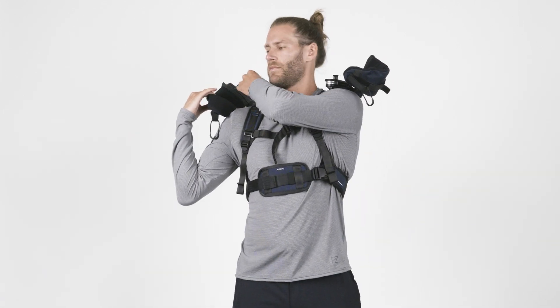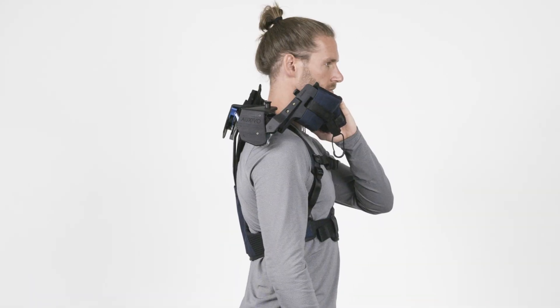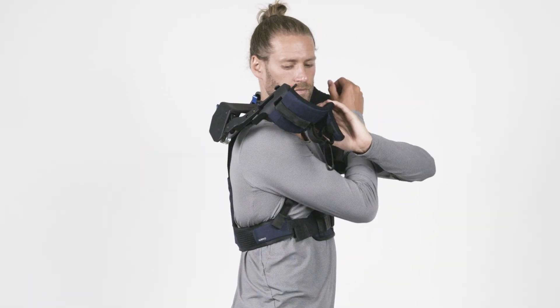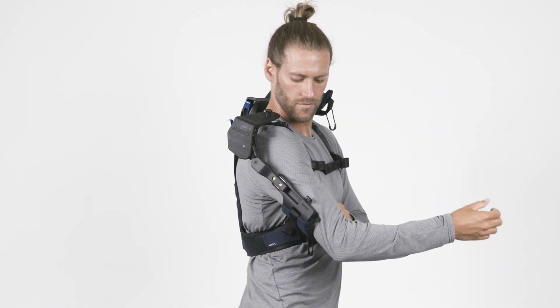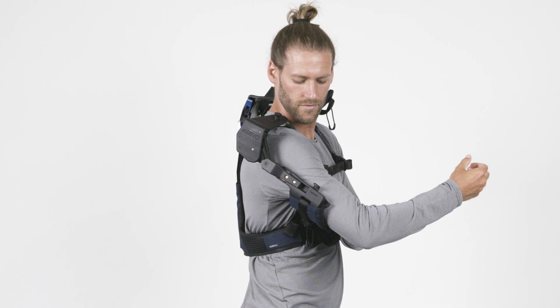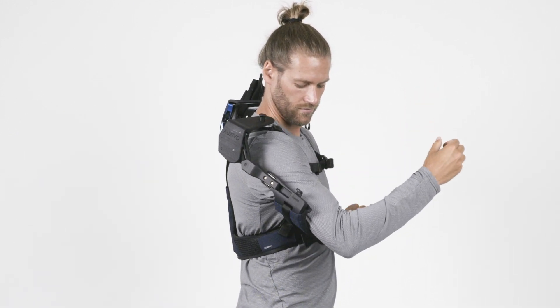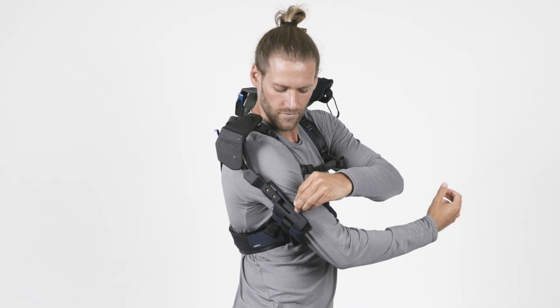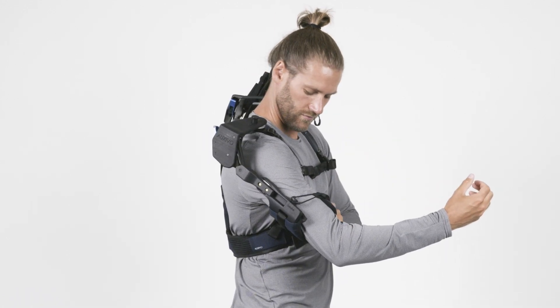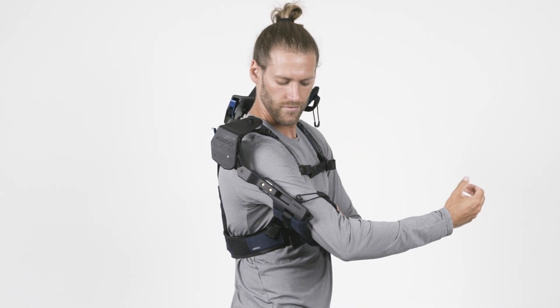Next, unlock the first shoulder joint by pulling the locking pin out of the socket. Pull down the cuff with your opposite hand and put your arm inside. You can adjust the length of the arm using the telescopic mechanism. Make sure the cuff is positioned comfortably, then close the cuff using the loop and hook. Use the elastic Velcro strap to tighten or loosen the cuff — it should be tight enough to avoid slipping but not too tight to be uncomfortable.